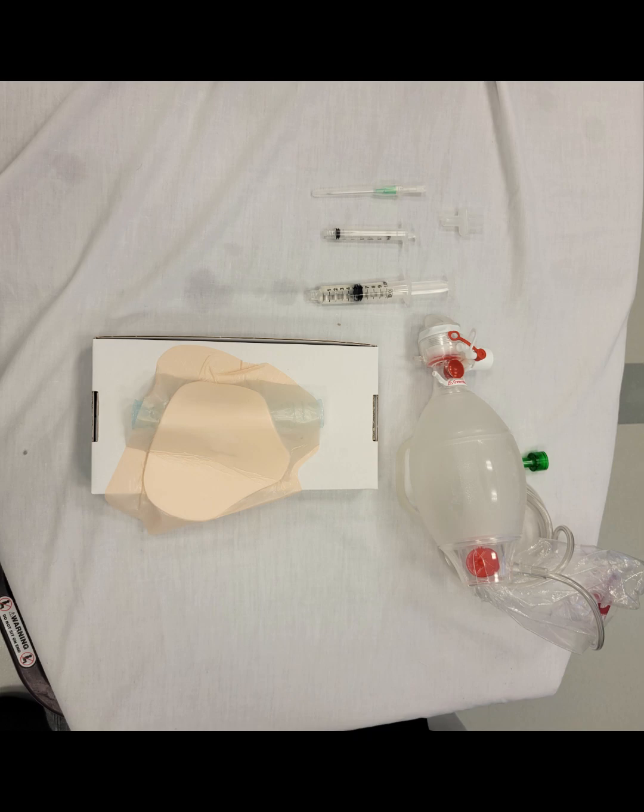For the needle cricothyroidotomy, you will need a large bore needle with angiocath, about 14 gauge will be appropriate, a BVM, an ET tube, a 3 milliliter syringe, a 10 milliliter syringe filled with saline, and an ET tube connector piece, either a 3.0 which will fit directly into the angiocath, or a 7.0 which will fit in and attach to the 3 milliliter syringe.